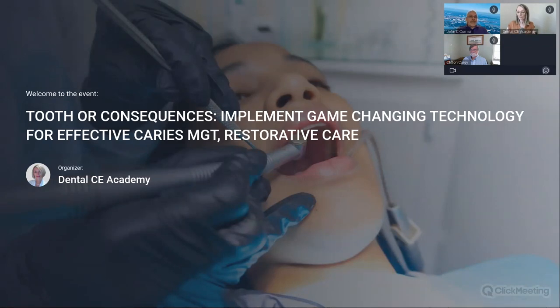If you want to air thin it, you can, but I find that because of the ethanol solution that it's in, the ethanol dissolves and dissipates rather rapidly. So by the time they get their bonding agent in there, it's already dry and ready to go. And then you put your bonding agent onto it. It interfaces with the K21 material nicely.